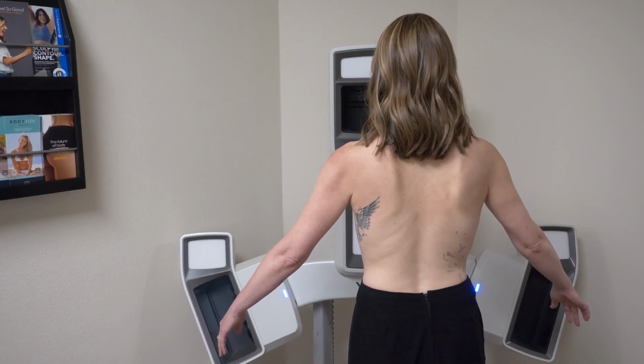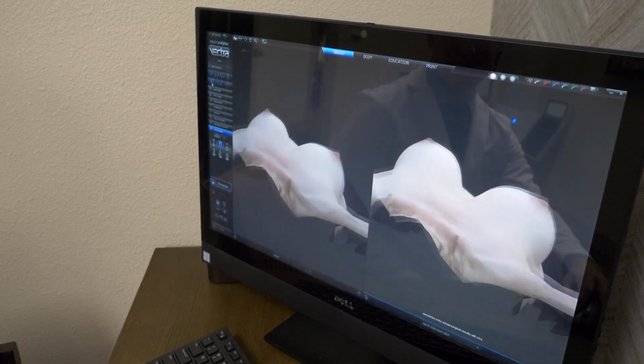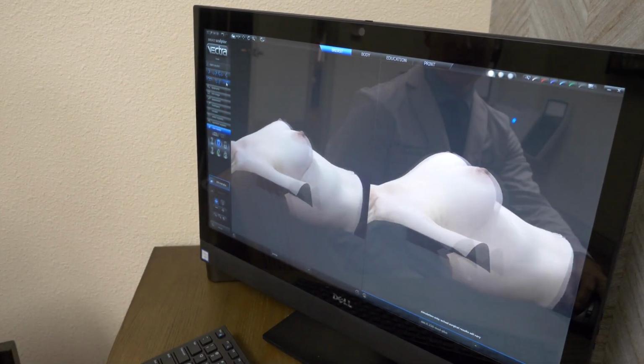Vectra is an imaging device that we can use to morph a patient. Commonly I use it in breast augmentation, where we take a picture of the patient and the computer program plots out all these measurements on the patient. Based on that, it uses an algorithm to either enlarge the breast, decrease the size of the breast, or lift the breast up.